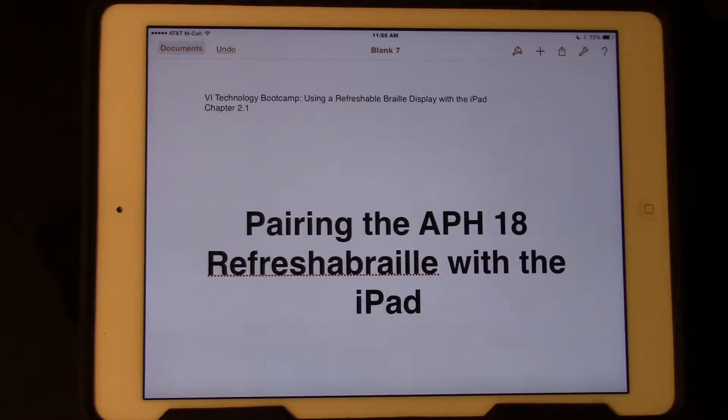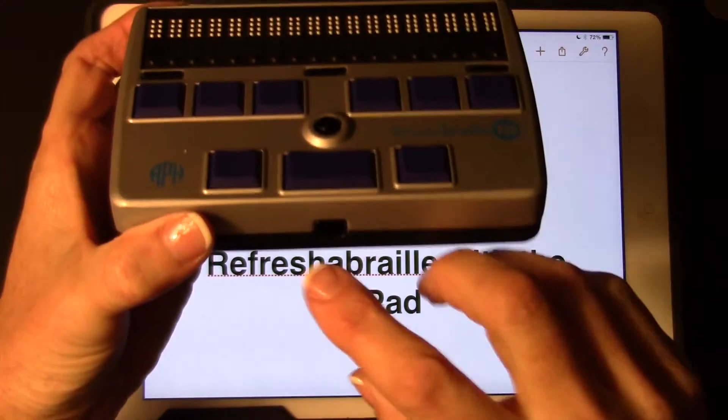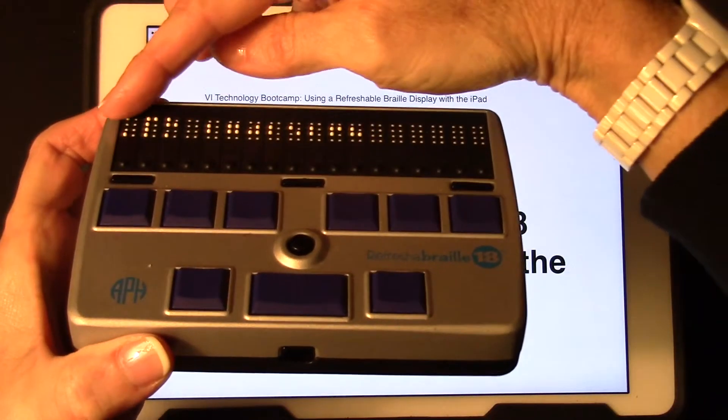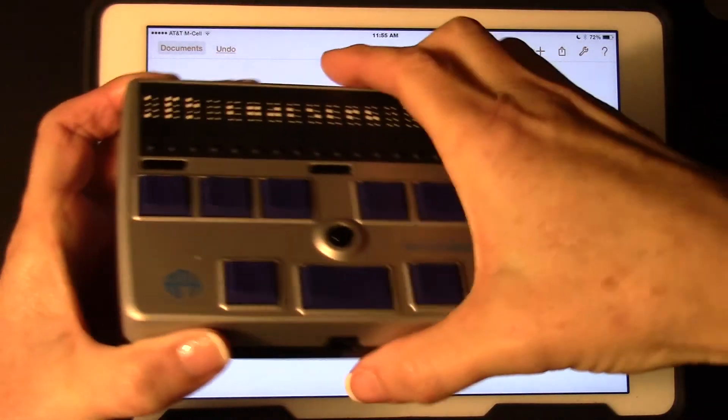This video will demonstrate how to pair the APH18 Refresh-A-Braille with the iPad. First, turn on the refreshable braille display. Now you will see APH and the serial number displayed in braille.